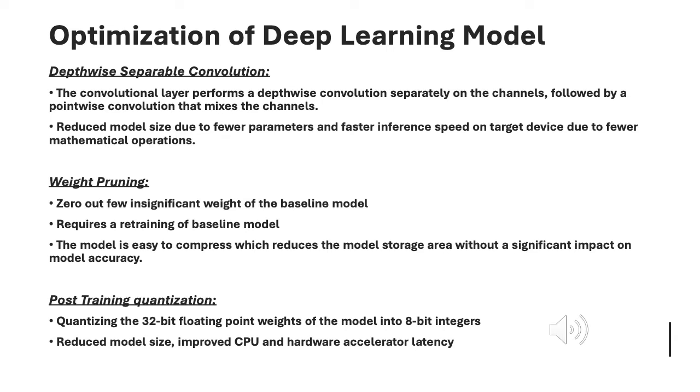During inferencing, the weights are reconverted from 8-bit precision to floating point using floating point kernels. This conversion is done only once at the target device and cached to reduce the memory.